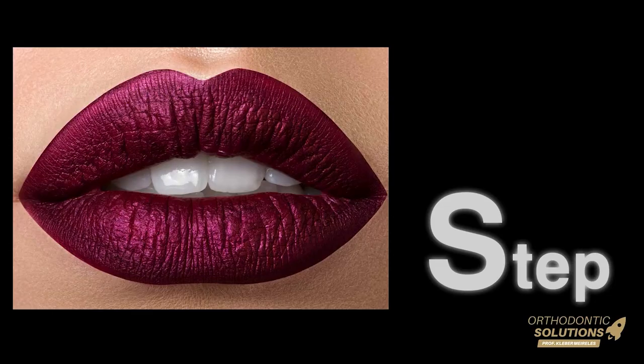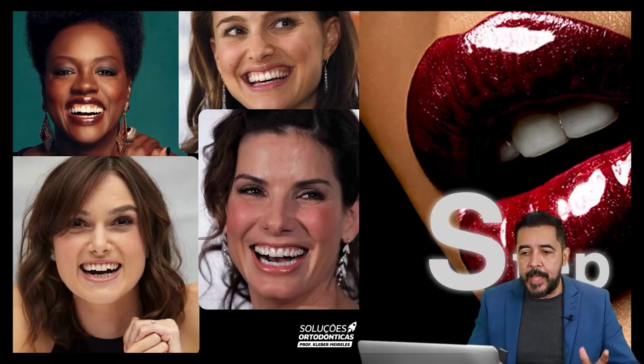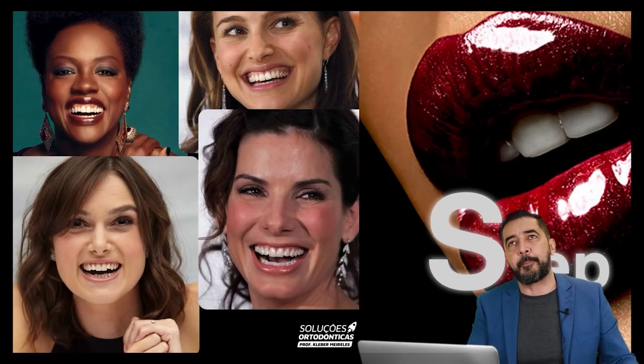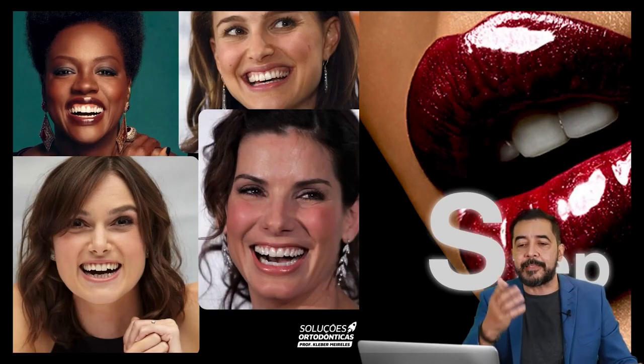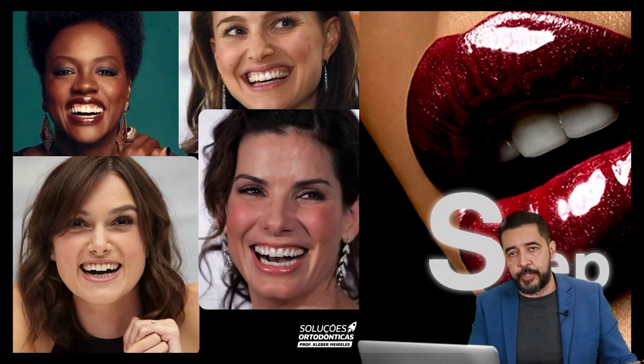So I ask my patients, what do you want? Do you want a 0 millimeter step? And I explain what step means, and I explain that I can change that. And I ask them, what do you prefer? And I know that step is beautiful because many people like this kind of step, because it also resembles youthfulness.